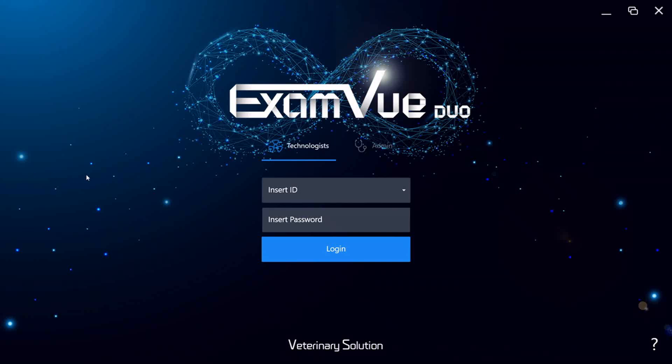Hello and welcome to our demonstration of ExamView Duo X-ray Acquisition Software. We're very proud of the work we've done on developing the software to be as easy to use and learn as possible while still having the full features you need for your practice.